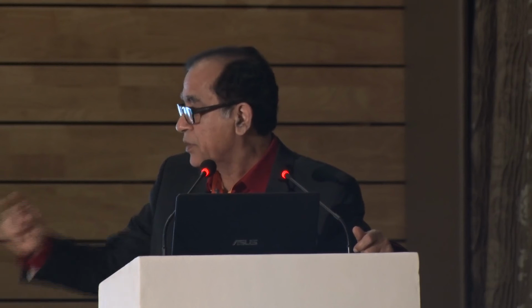Every time there was fibrosis, we did retinotomies, then lasered around that area, so it will keep on getting fibrous at various places, it will keep on crumbling, then go inside. The vitreous was already removed. It was shrinking, so we cut the retina, do the retinotomy and laser around it, and then go ahead. So ultimately we could say.